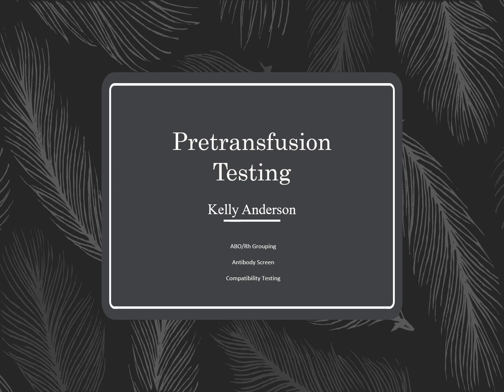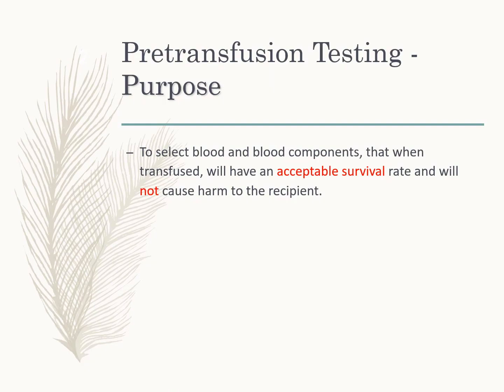Hello. Today we are going to be talking about pre-transfusion testing. This includes type, screen, and crossmatch. Why do we do pre-transfusion testing? To select the best possible blood or blood products so that when they're transfused, they'll have an acceptable survival rate and they will not cause harm to the recipient.